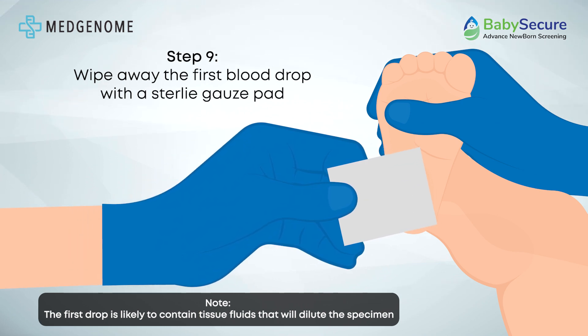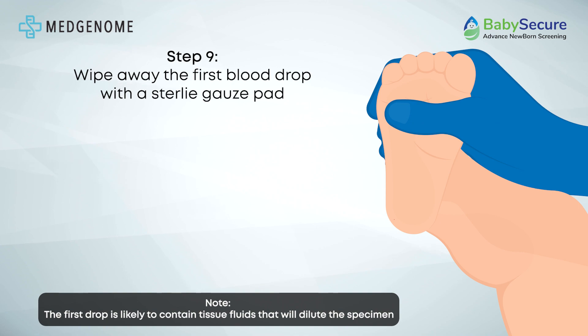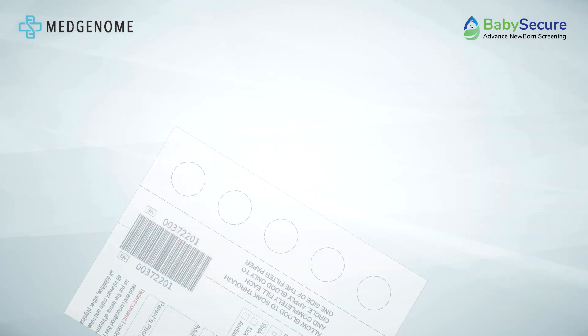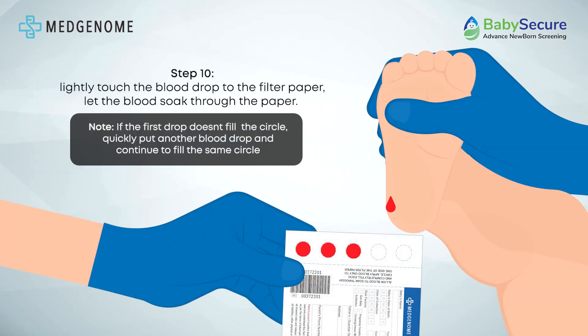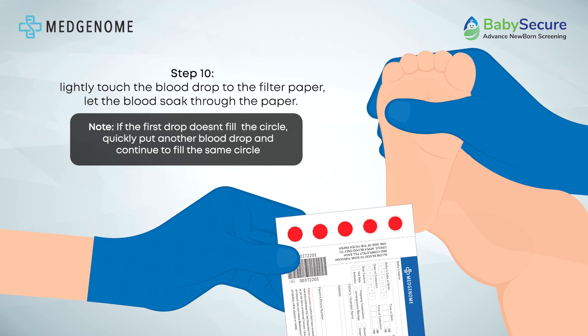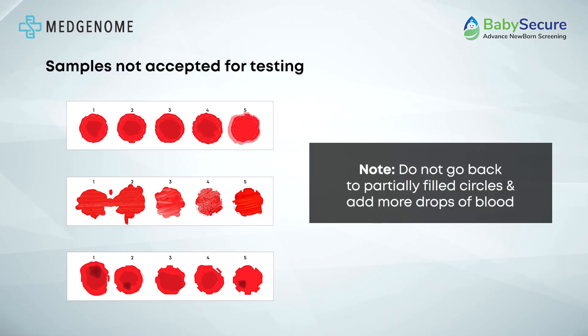Remove the initial blood drop with sterile gauze to eliminate tissue fluid contamination. Wait for a second large drop to form, then apply blood drops to one side of the filter paper. Avoid milking the heel or puncture site. Gently touch a large blood drop to the filter paper, allowing absorption, and add additional drops if needed to fill the circle completely. Avoid revisiting or adding more blood to partially filled circles.